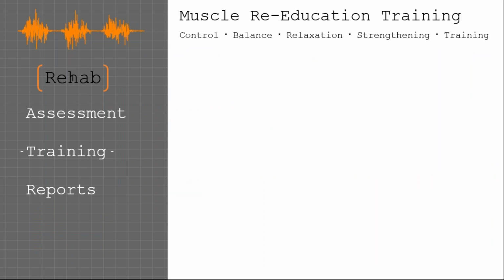Once we get through our assessment, then obviously the next step, maybe one of the most important steps, is what sorts of training am I going to do to bring that muscle back to a normal state.